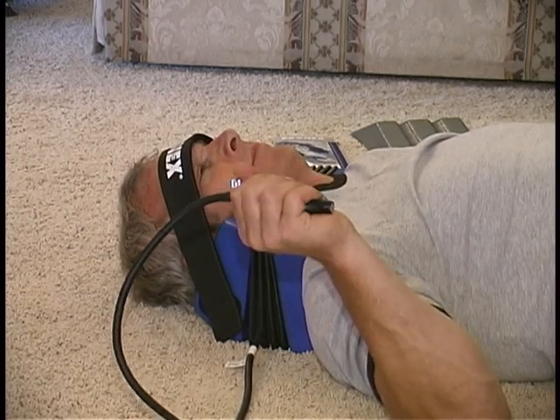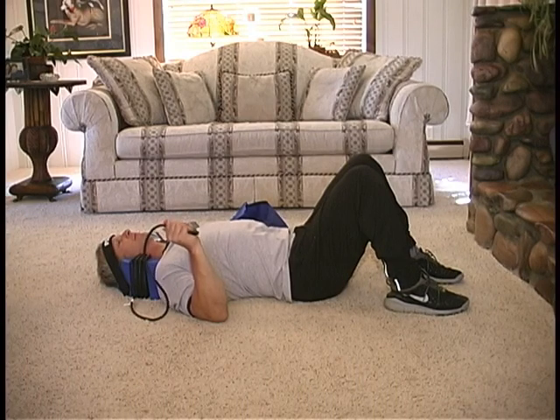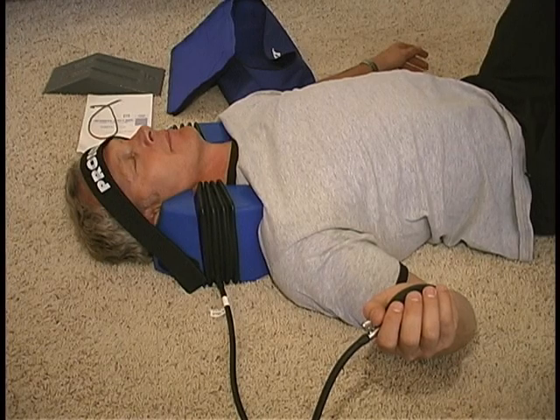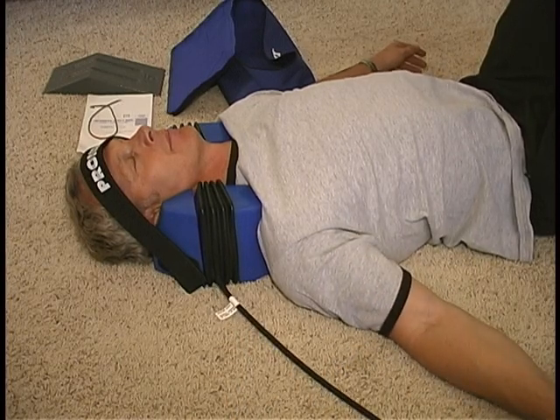With the valve closed clockwise, begin inflating the unit until you feel a gradual stretch. This cervical stretch will relax the muscles. After muscles have relaxed, continue inflating PRONEX and repeat the process each time, allowing your muscles to relax. It is important to close your eyes during treatment and keep in mind that relaxation plays a key role in the effectiveness of successful cervical traction therapy.